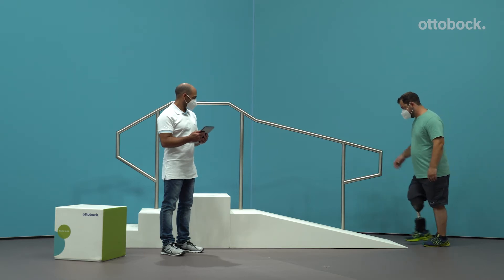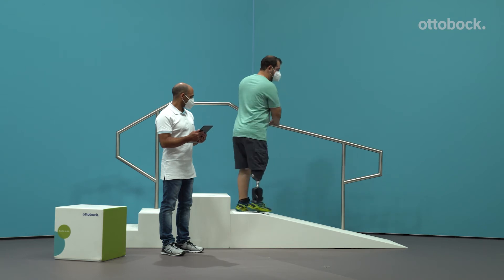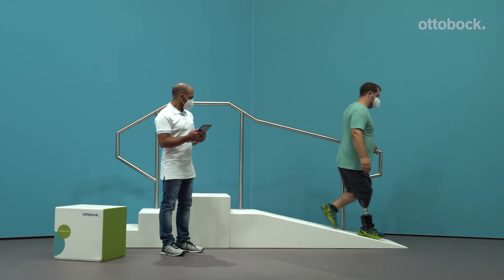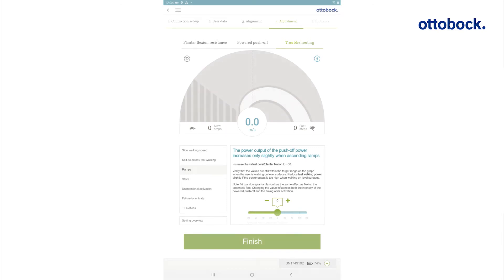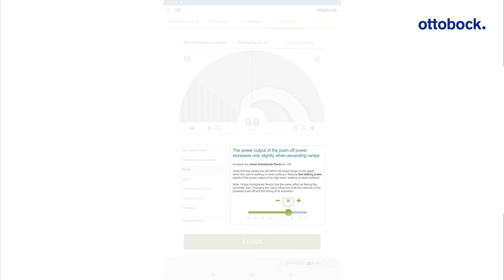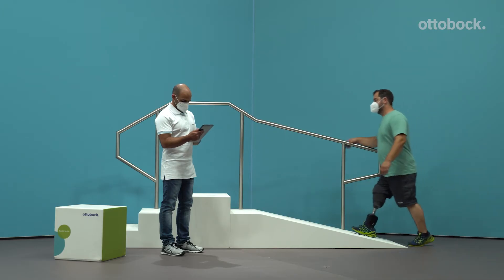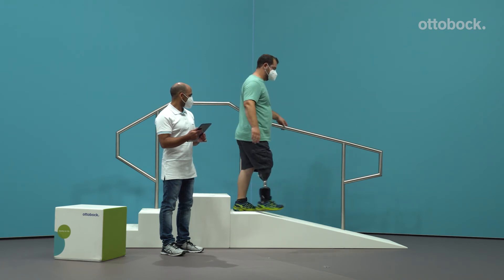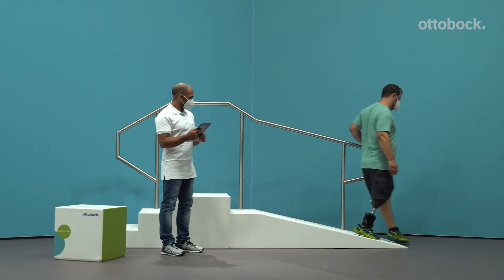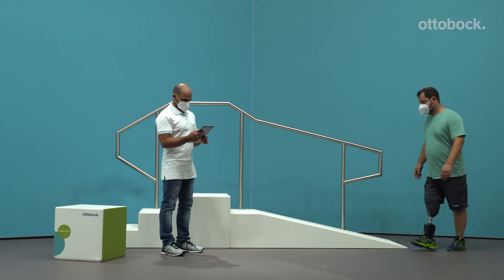The user reports the power output is inadequate or inconsistent when ascending ramps. Increase the virtual dorsal plantar flexion to plus 30. Verify level ground walking steps still plot in the optimal range of the power output graphic. Reduce the setting for fast walking power slightly if the power output is too high when walking on level surfaces.